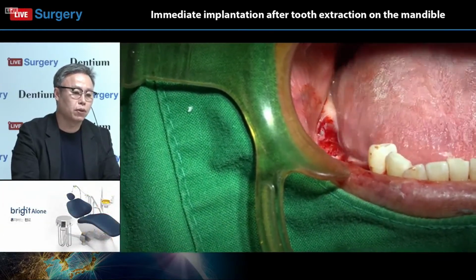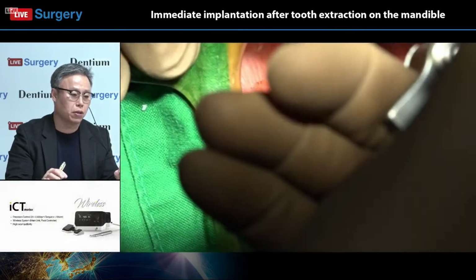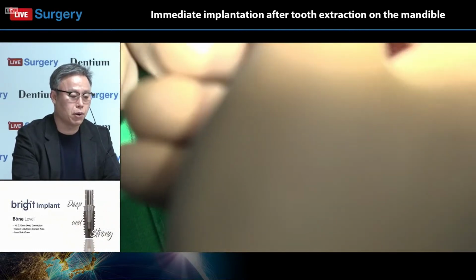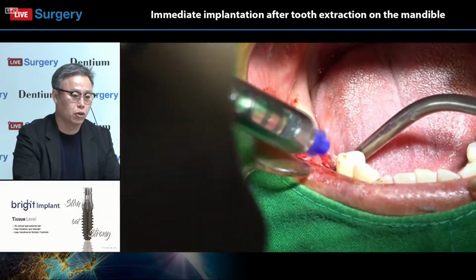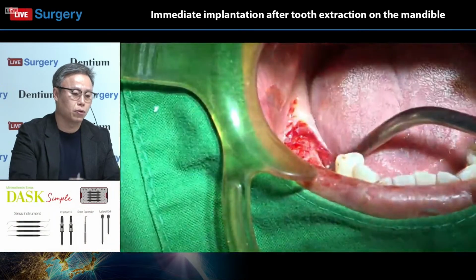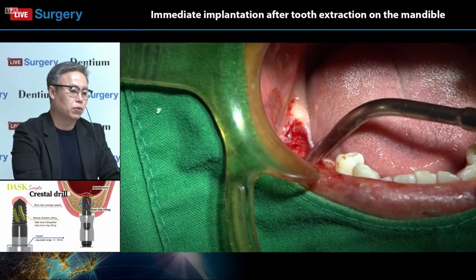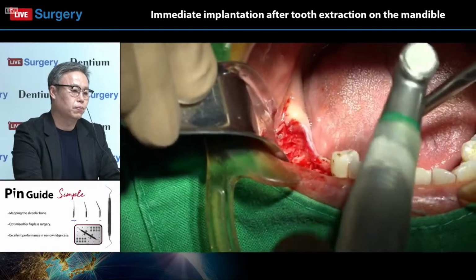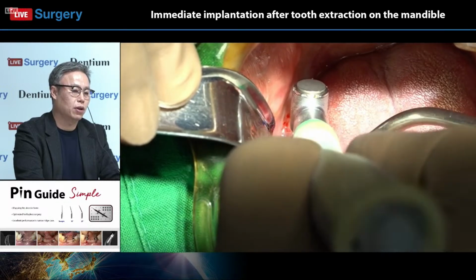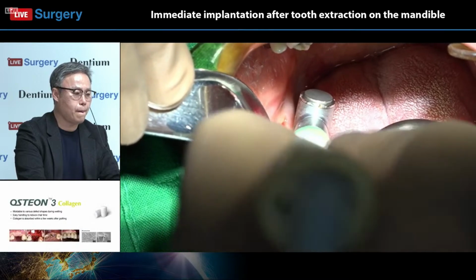As we all know, if two adjacent implants are too close, I mean less than 3 millimeters, there will inevitably be some peri-implantitis and peri-implant bone loss. As researchers say, nowadays the distance is decreasing because we are using internal connection type implants and also some platform switching types. However, this safe distance between two implants is 3 millimeters. I always keep it in mind when placing two adjacent implants.